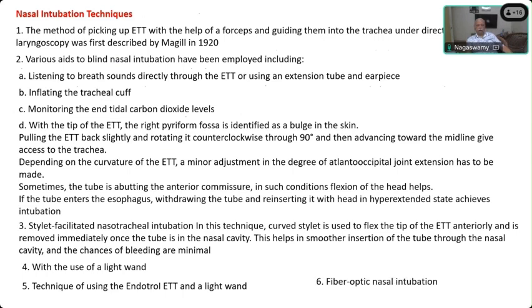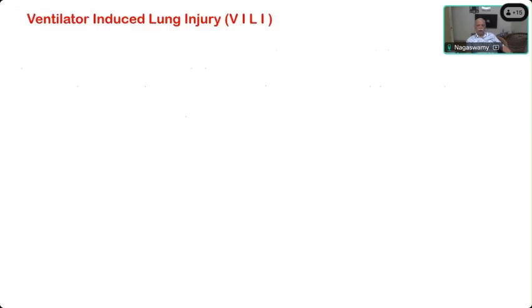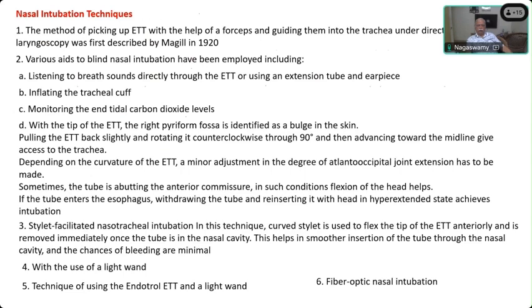Then there is fiber optic nasal intubation. So this is also an important thing that you have to remember. Without mentioning fiber optic, your answer will not be complete. This is the most important, the gold standard for nasal intubation nowadays in difficult intubations like TM joint ankylosis, burns contracture, and other conditions. So you must mention fiber optic nasal intubation also.